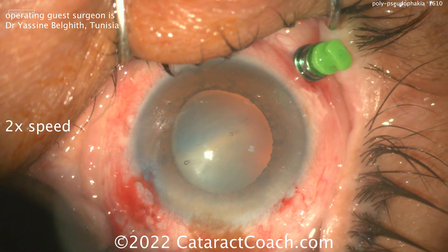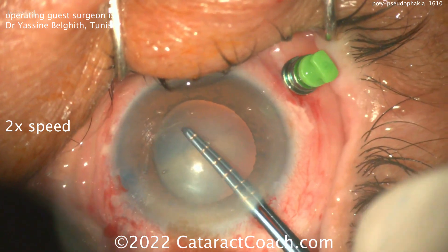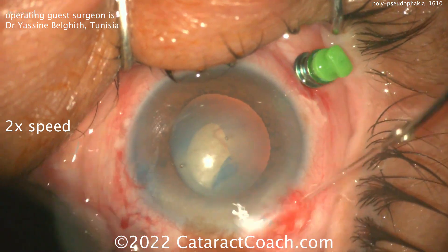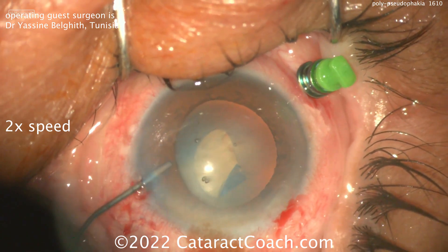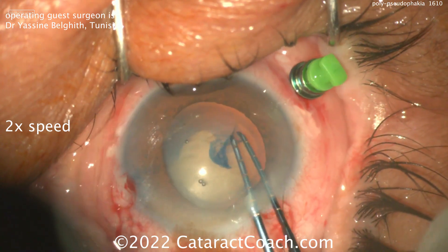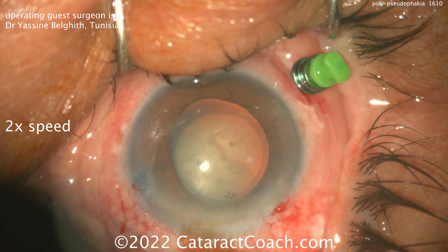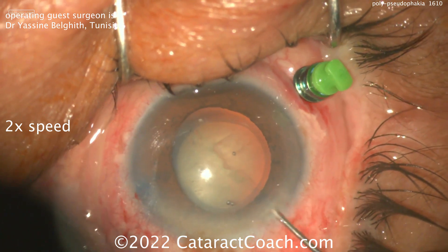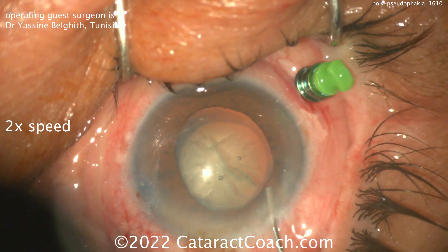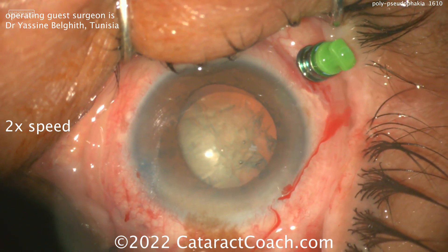Here we're starting off with the capsulorhexis in a very tiny eye. The question is what IOL do you implant? If you look at the lens calculations in this patient, it comes out to around 50-plus diopters for emmetropia. This patient is walking around highly hyperopic — at least plus six, eight, or ten diopters, maybe even more. The cataract being removed is probably four to five millimeters thick.